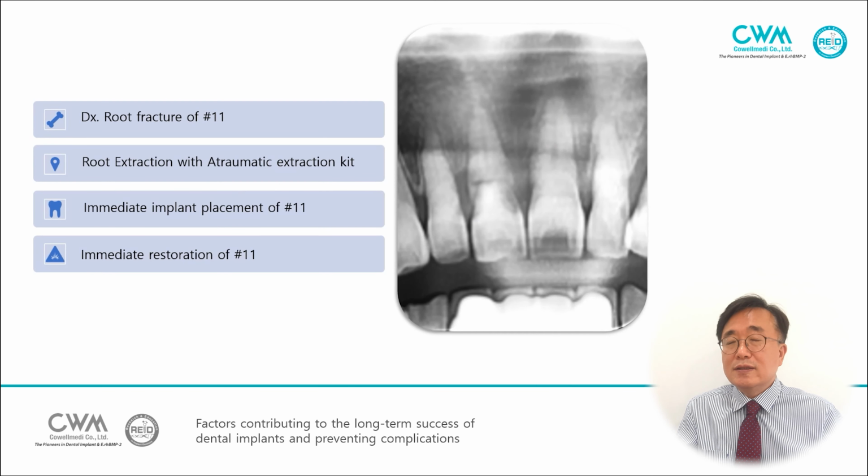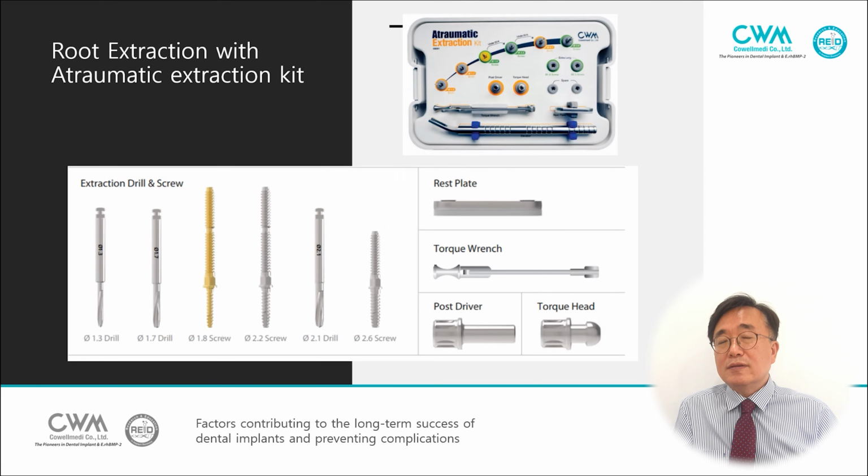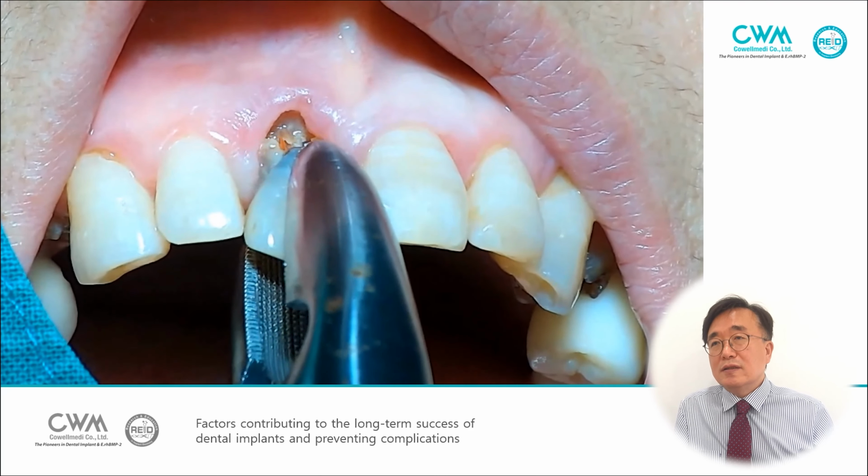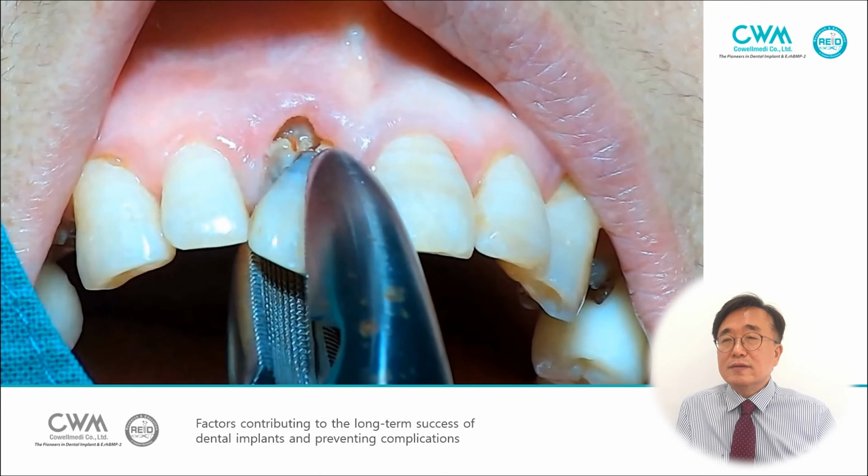So I will show some cases here. This 11 tooth is extracted. I used the atraumatic extraction kit. Here, the crown was fractured.